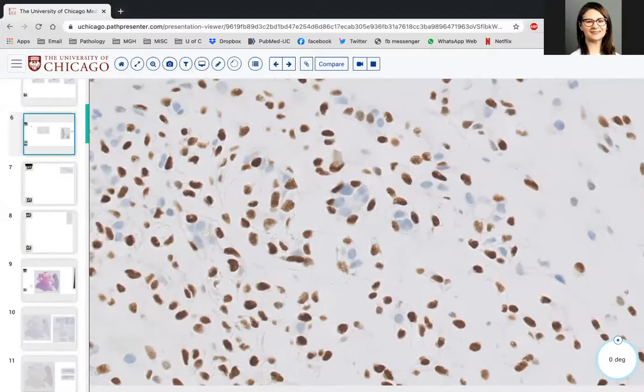So we have a comment here for myoepithelial carcinoma. Right, no palisading like you'd expect in basal cell neoplasms, and maybe genetic testing. So yeah, I think we've excluded perhaps a pure myoepithelial carcinoma because of the biphasic distribution, which you can see nicely in these ducts. And Christina, on genetic testing, what would you be thinking about?